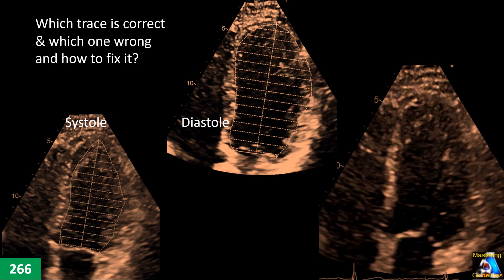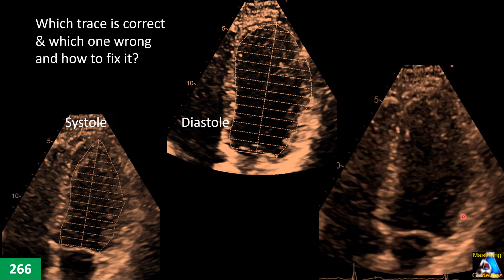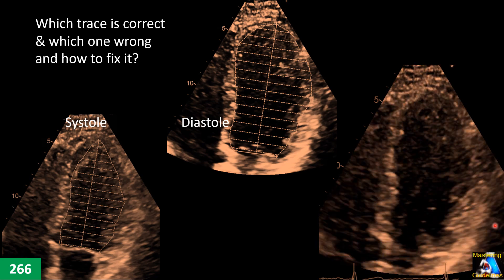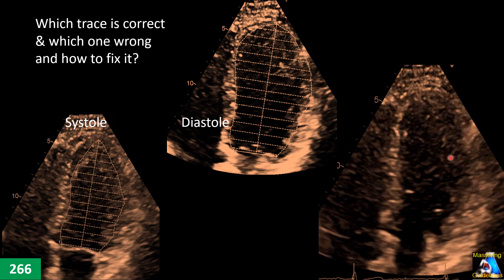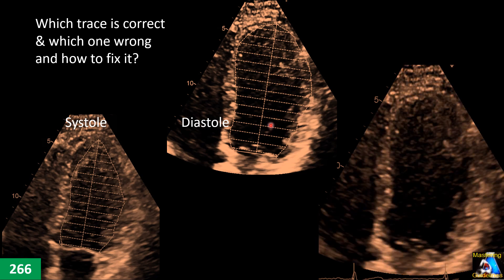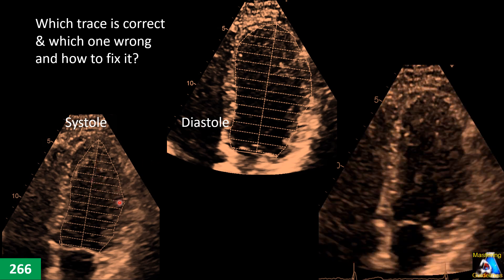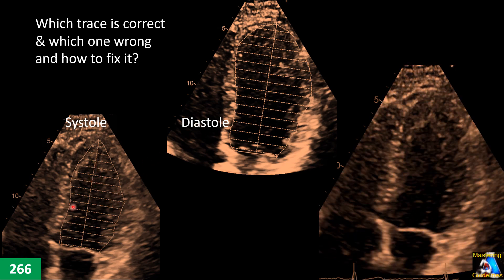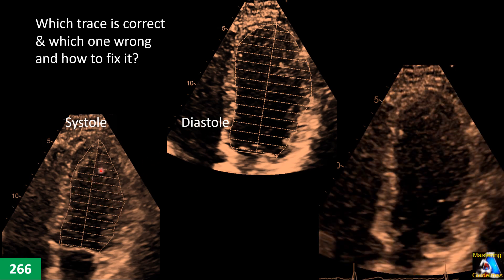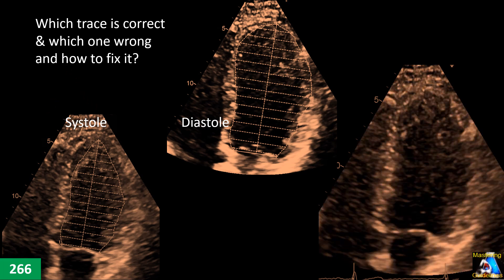Here is another one in 2D. You can see the endocardium fairly clearly, but diastole and systole have been traced like this. Which of them is correct, which is not, how do we fix it, and what is the correct one?